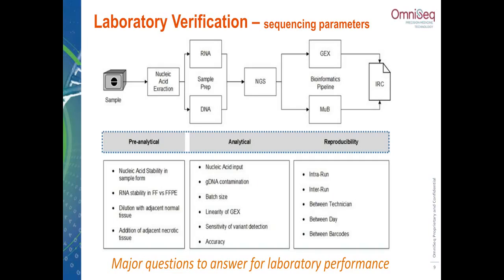I think Fiona really focused on that ability to identify low expressors, and I think that's a very important point. If you go look at whole transcriptome studies, you will see that whole transcriptome from fresh frozen tissue really does not work well at the low expressors. There are multiple reasons for that, but this assay seems to work extremely well at that point compared to whole transcriptome.